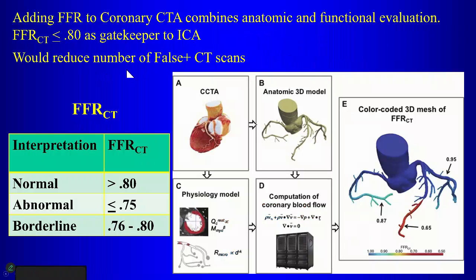So what's the implication of this for cardiac CT? Well, it turns out that with coronary CT, there is a way to get these numbers for fractional flow reserve. Right now, it involves sending the data set out to an outside laboratory. They use complex computational models, modeling fluid dynamics on your coronary CT data set to actually calculate fractional flow reserve for the various vessels.